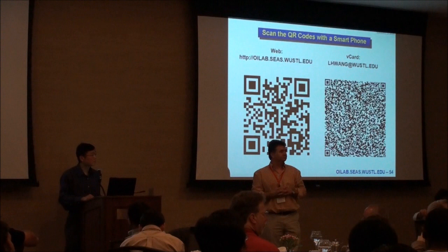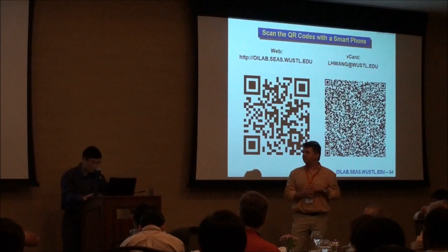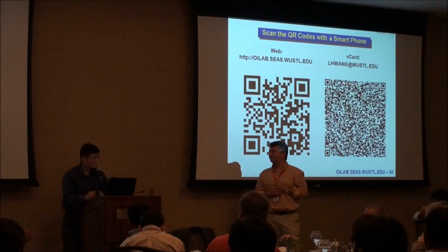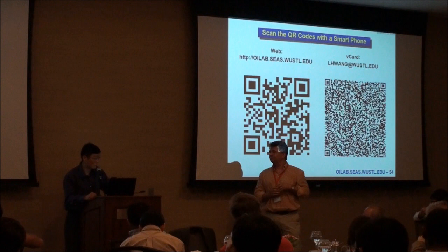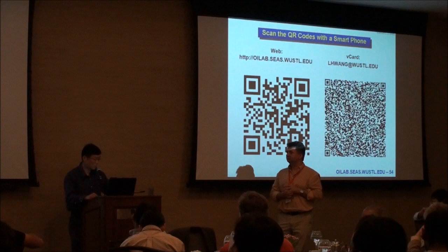Can you discuss a little bit about photodynamic therapy? So any nanoparticles that are optically absorbing will be able to be detected by photoacoustic tomography. We basically detect optical absorption. We tested nanorods, nanostars, nanoshells, nanotubes, you name it. Most nanoparticles are optically absorbing, so they show up quite nicely in our images. Photothermal therapy, of course, you can enable that as well. It's based on heat. Photodynamic therapy is based on photosensitizers. Both are compatible with what we do.